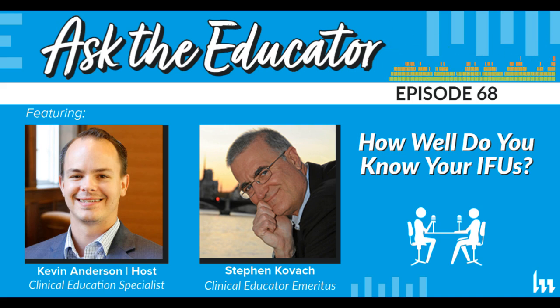I mean, did you know, Kevin, that there were two manuals mostly on all these scopes? I did, only because I had run in both roles. I had to use the endoscope, hook it up and test it and all of that, but I also had to be aware of processing.